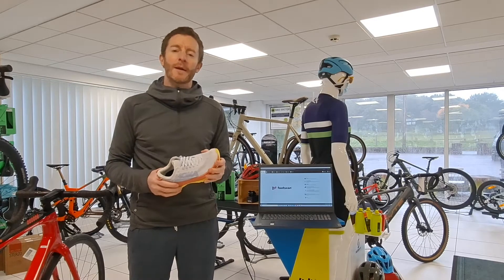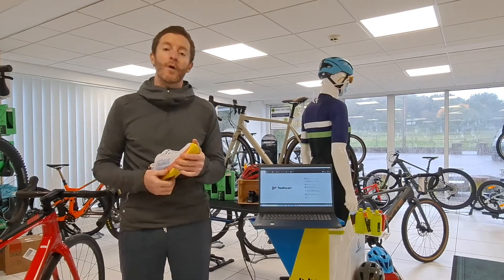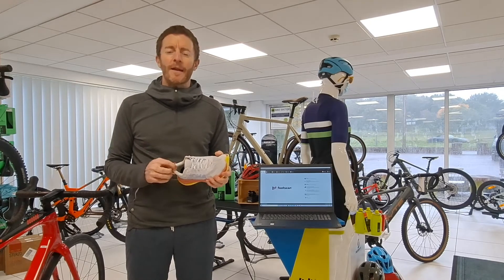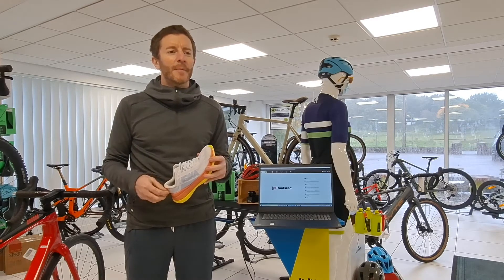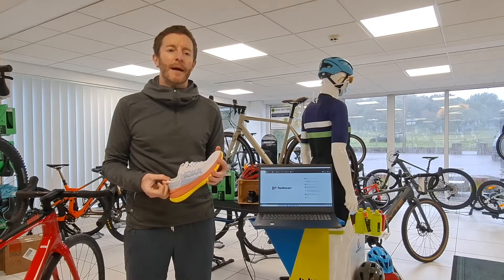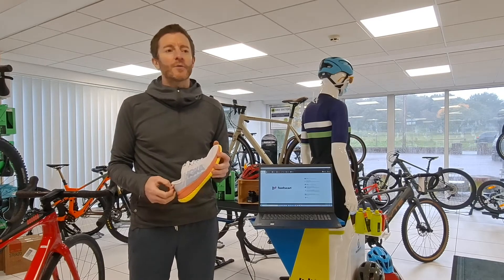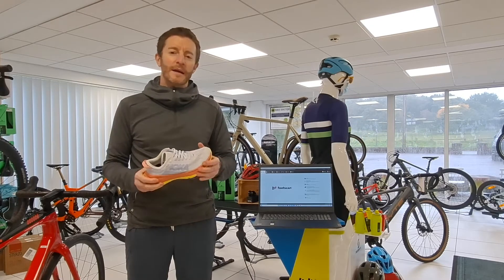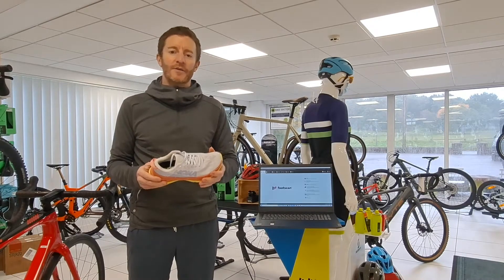We've had our running store for a couple of years now and we get asked a lot for gate analysis — a lot about what shoe is right for me and all that kind of business. Gate analysis has always been a little bit of a frustration from our point of view, in that being reasonably honest it doesn't give a huge amount of information about how the body and the shoe is actually performing. Yes, it shows to a certain point about pronation or supination or neutral, but it doesn't really give a huge amount of information about how your foot is actually performing.